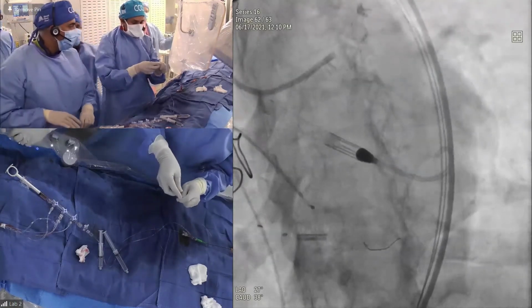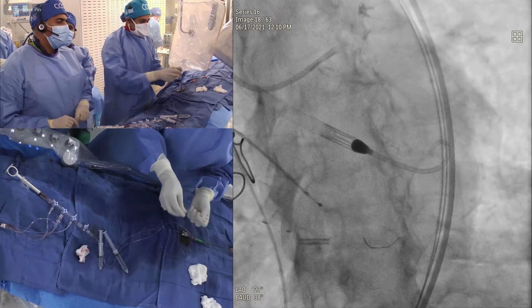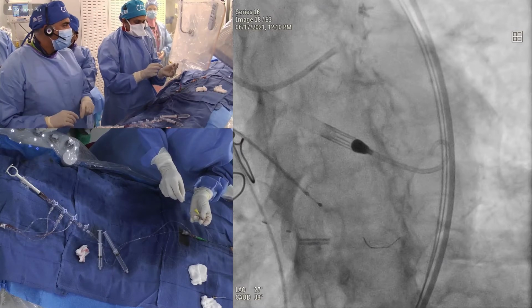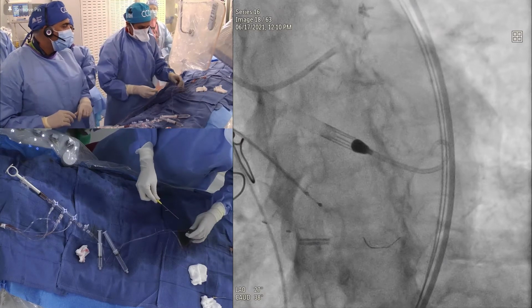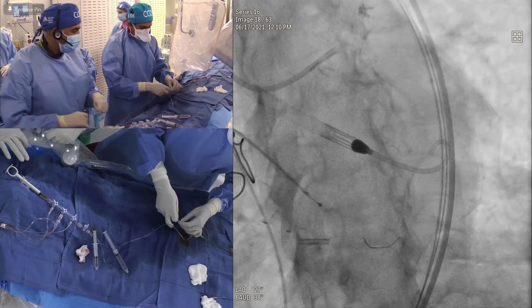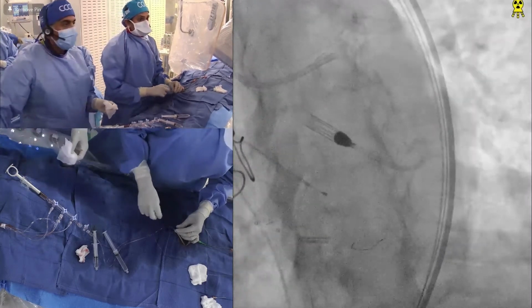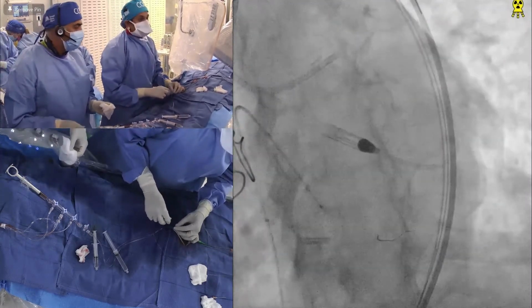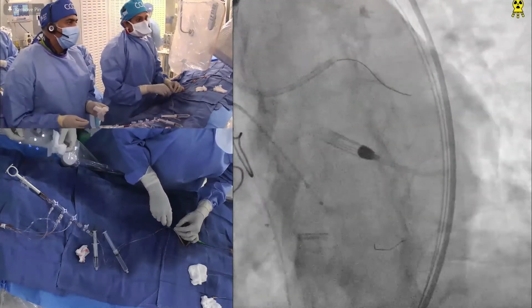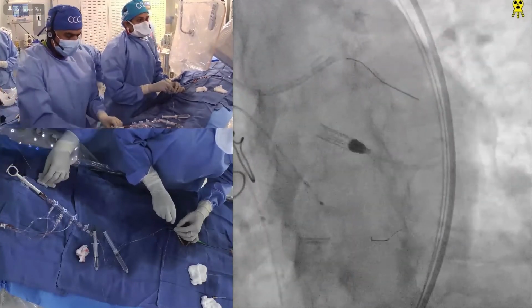But remember, very important, what I say in the angulated lesion, and this question comes up all the time. You may not have done the ablation, which is the point you are making. The key is, if you cut the internal elastic lamina, you have really disrupted the architecture of the vessel. So the goal is your balloon should expand it. You're right. We have not done much ablation, but we have cut the internal elastic lamina because of eccentricity. As long as your balloon expands, your mission is accomplished, and now your stent will expand. So that's the reason. You're right, if we just go by the principle of debulking or plaque modification, this is not the right approach.